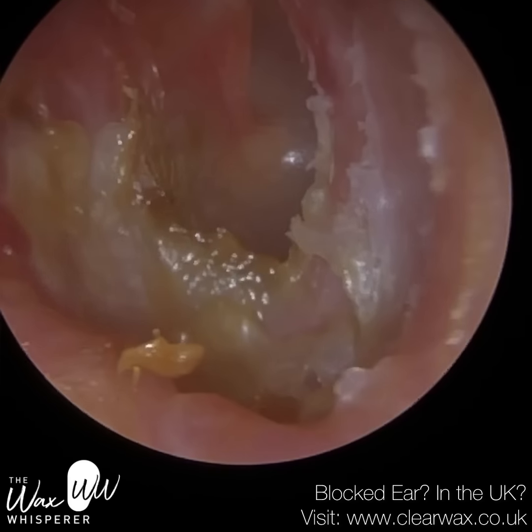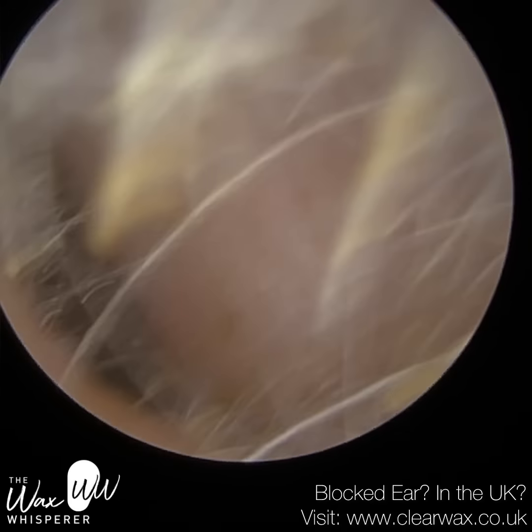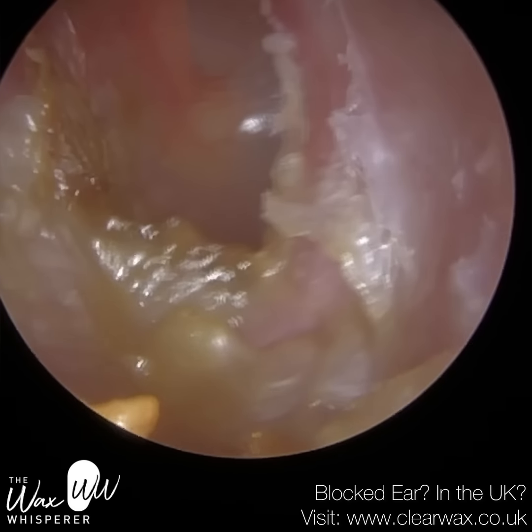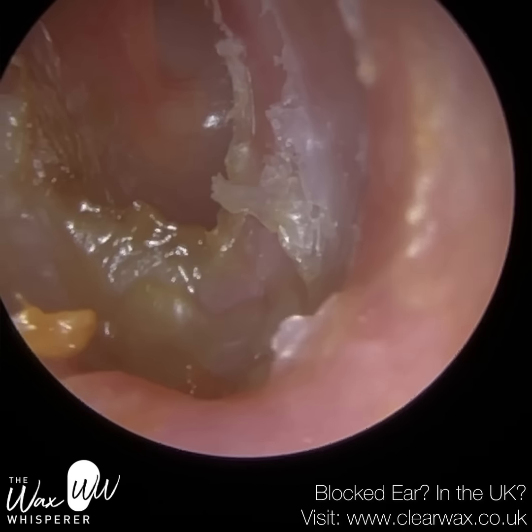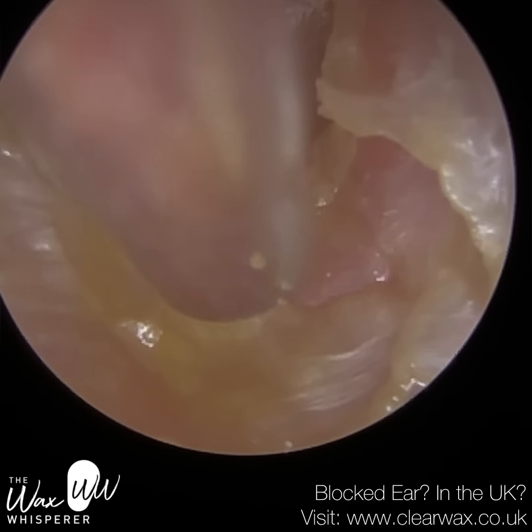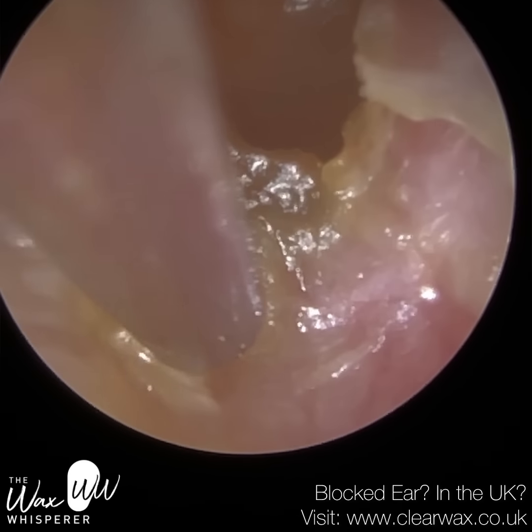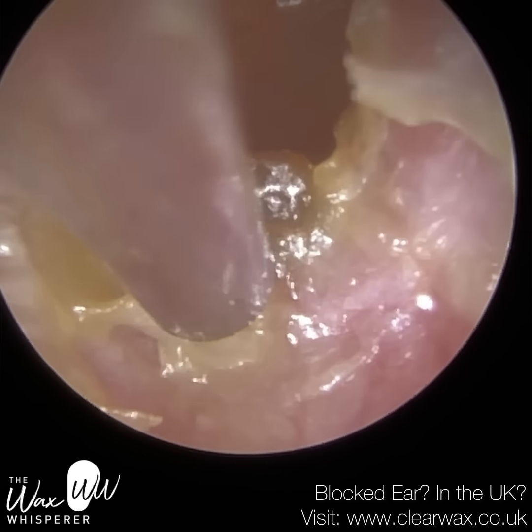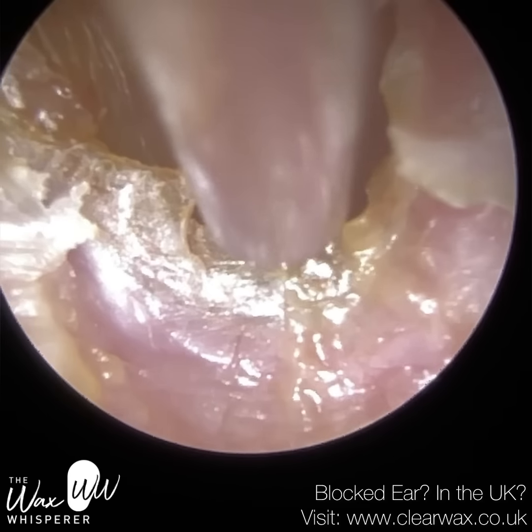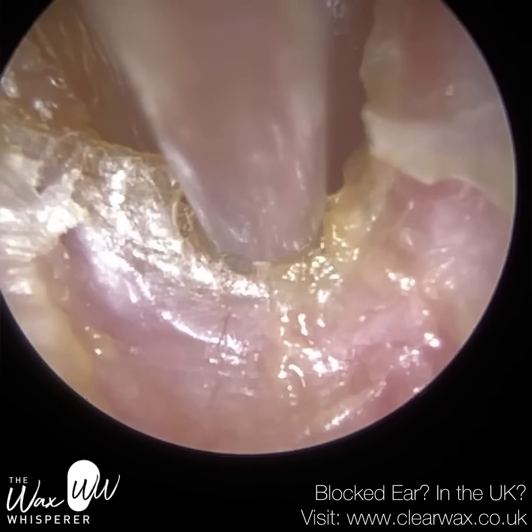There's also inflammation in front, laterally, of the keratin plug on this side. And a grade 4 is when the widening is so severe that it invades into adjacent structures, so as I described before, the TMJ or the skull base, the floor of the jaw, or posteriorly to the mastoid. So that's your classification system. Grade 4 typically has to be removed surgically. Even there's cases that I've read where grade 1 and grade 2 and grade 3 has to be done surgically, just because it can be very, very painful. The patient attends with pain already, and it's excruciating acute pain that a patient generally experiences with keratosis obturans.